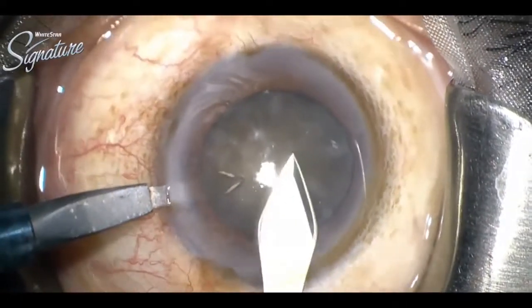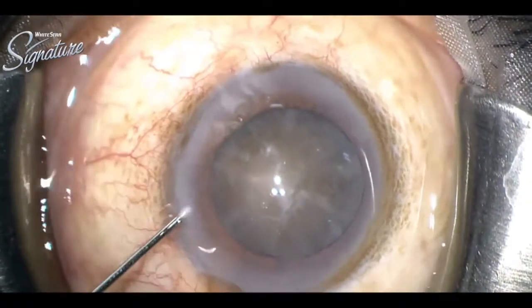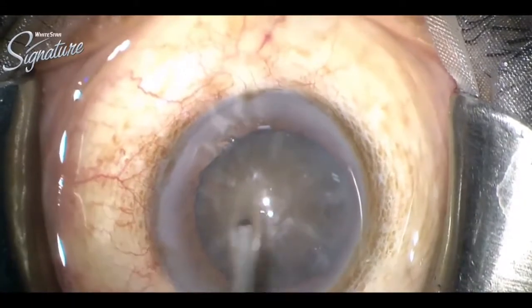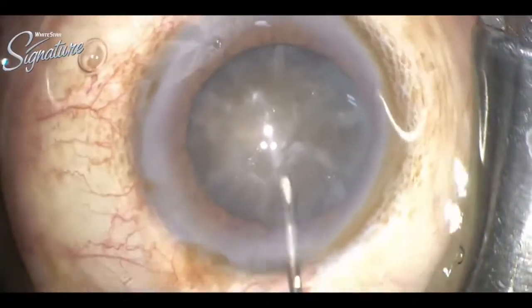Entry was done, then a clear corneal trapezoid incision was done on the temporal side. This preserved incision maintains good anterior chamber stability.